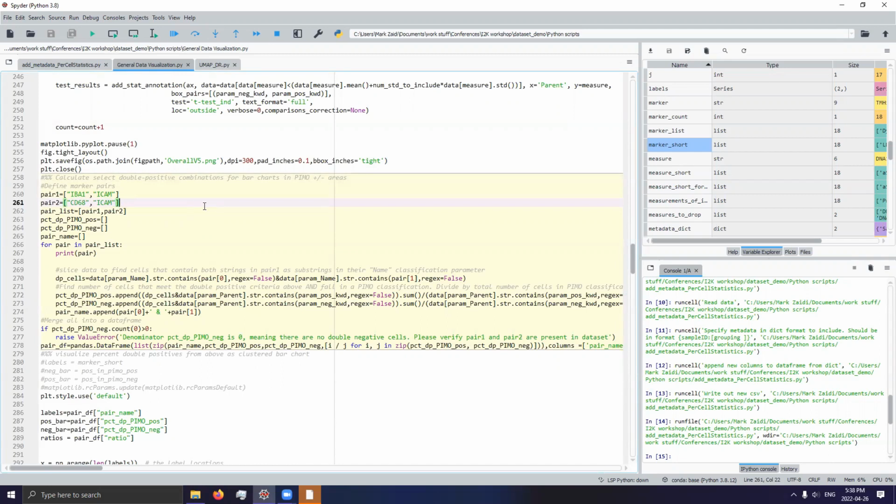Now, in conventional clustering techniques for cell classification, such as PhenoGraph, you don't really have to worry about this. Instead, you look at heat maps of each cluster and assign a cell type according to this. The challenge with using clustering to identify cell types is that you don't really have a way for a pathologist to make an informed classification for these cell types. And you also encounter issues if you have clusters that represent more than one cell type, or you might have multiple clusters representing one specific cell type.